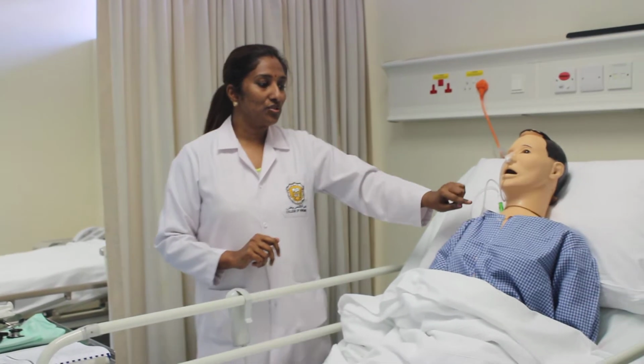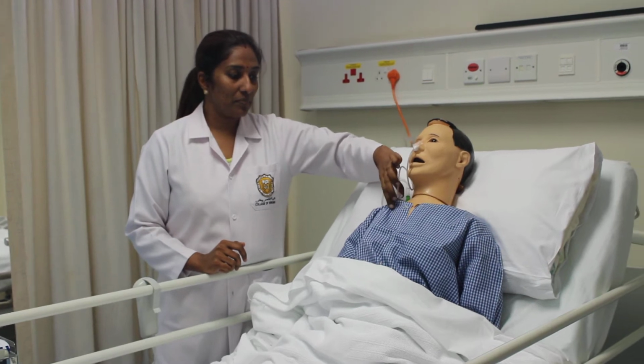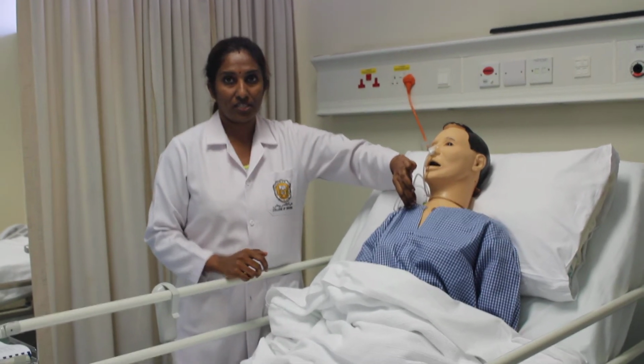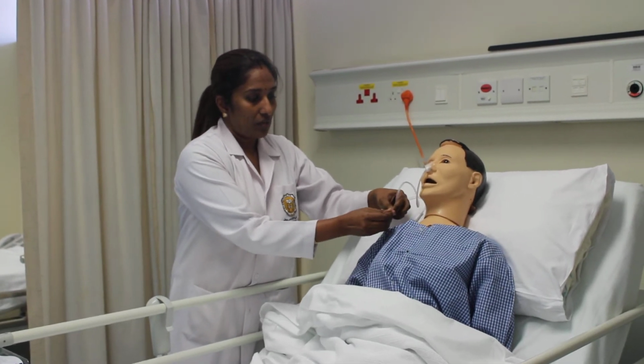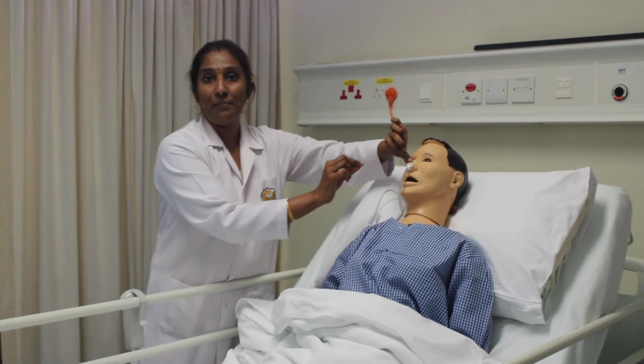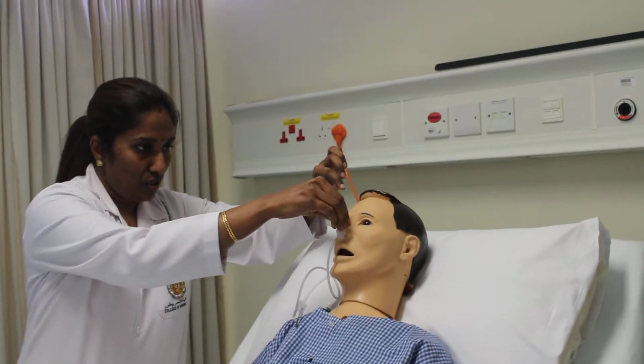You have to make sure that the tube, which you secured during the feeding with a safety pin, is attached to the patient's dressing, so make sure that this is loosened. Also loosen the tape which you used to fix at the nose edges.